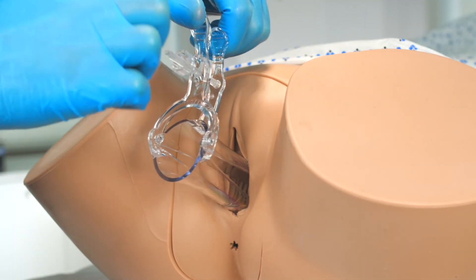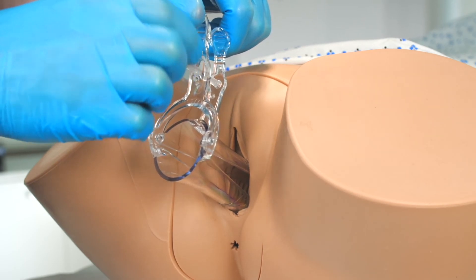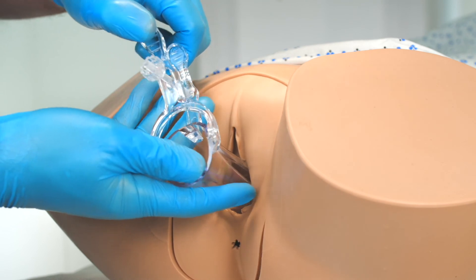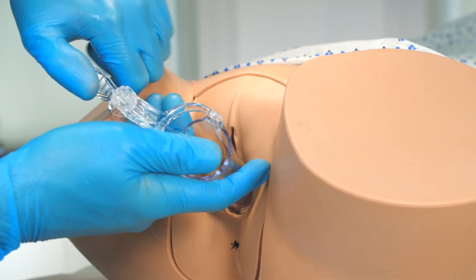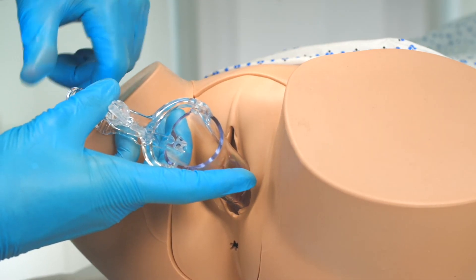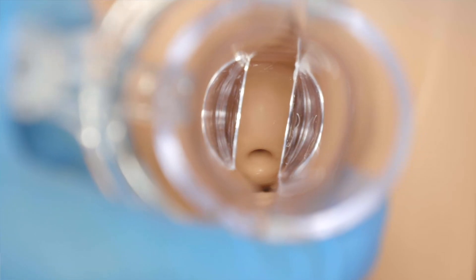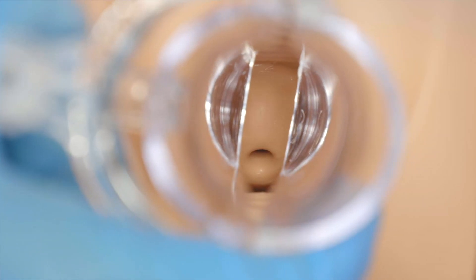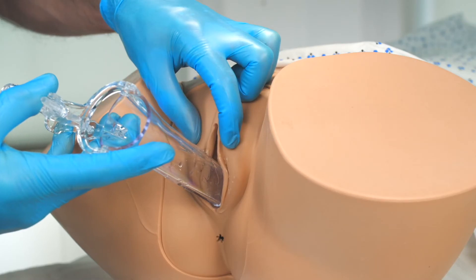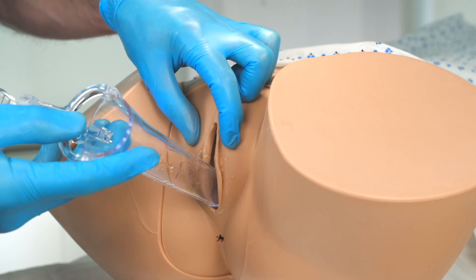We can now remove the speculum by untightening the thumb screw, but keeping the blades open, and slowly withdraw the instrument to enable us to inspect the vaginal walls as we do so. The speculum is rotated 90 degrees so that the handle now points towards us, and this allows us to visualise the anterior and posterior walls of the vagina. As the blades approach the introitus, we then allow them to close, taking care not to pinch the pubic hair or the labia.